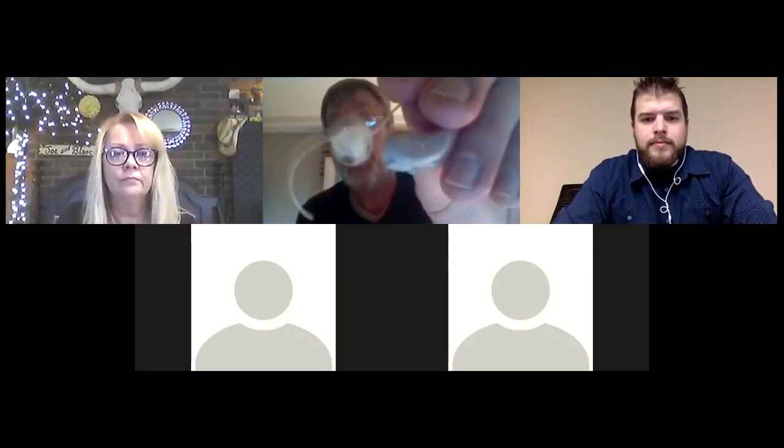Well, today's hearing aids are mostly these guys. So when you're using this, look at the vents there. Look at that sucker. It's got 3 big holes in it. So there's a dome with 3 big holes. This is at least a 4mm vent. So this is going to be great for someone who has excellent low frequency hearing and quite a high frequency hearing loss. So today's hearing aids tend to use vents as well in the dome.